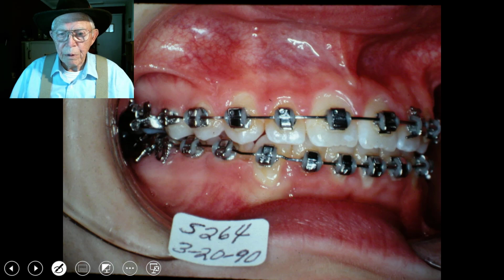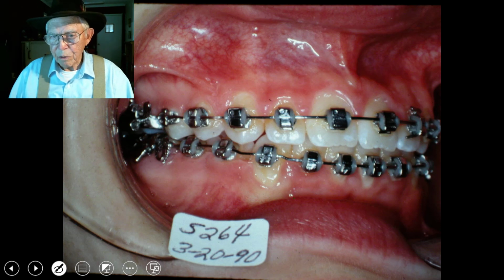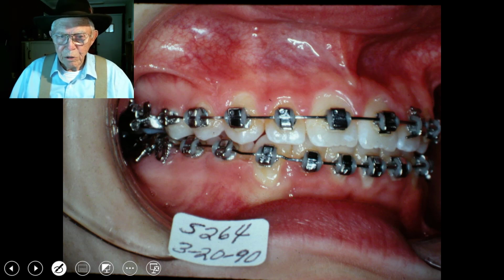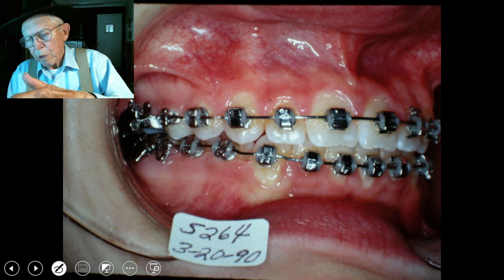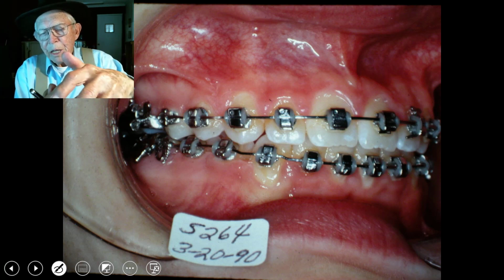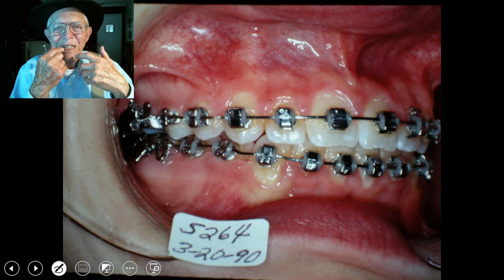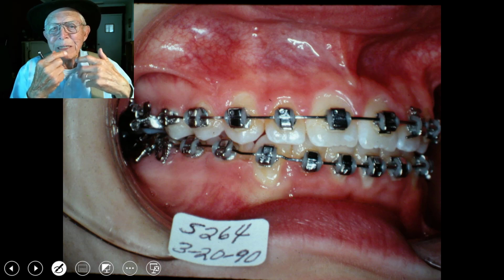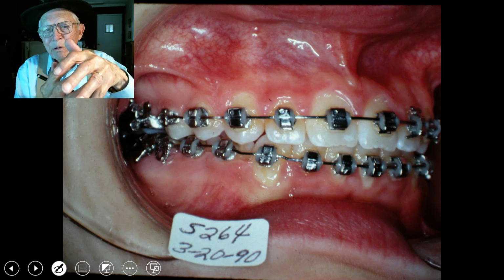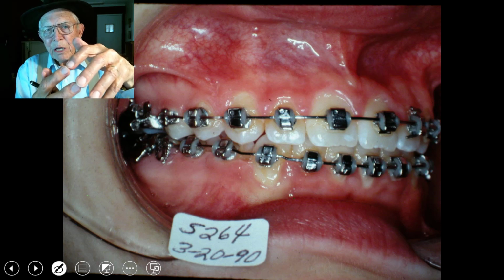Okay, we did the separator, and we pull this on back, and we're just about to get this case completely finished, and we've got our lower anterior underneath here now, and we've got overjet, you see, and overbite, so that she can actually bite down. Now she bites something with the front teeth. The front teeth all touch, and you can cut something off with them like that, and then you slide back over here.